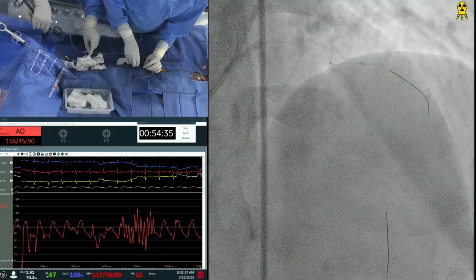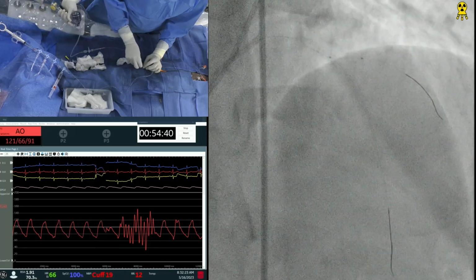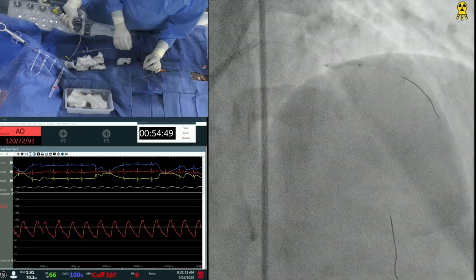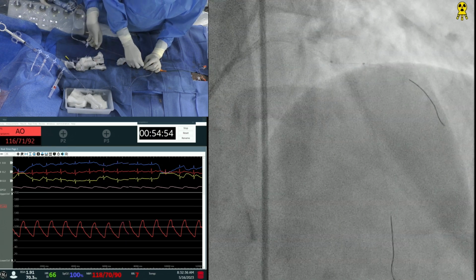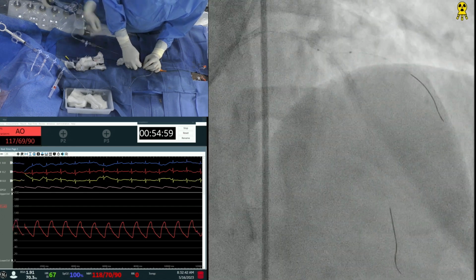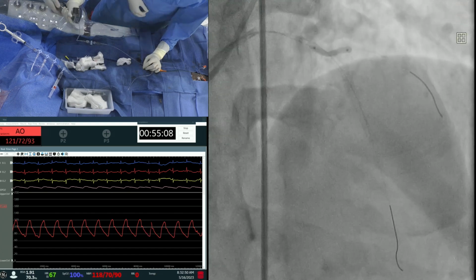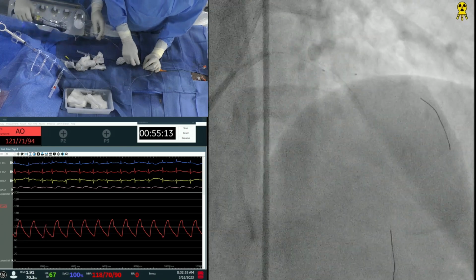Okay, this is a 2.5, 15 mm balloon. Down, NC Trek. This is NC Emerge, Boston. I'm going up, covering the ostium now, and we are going to 16 atmospheres. Okay, how is the IVUS? Look for a 2.5 by 16 also, but keep that stent ready for later.